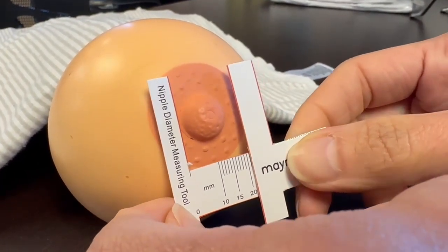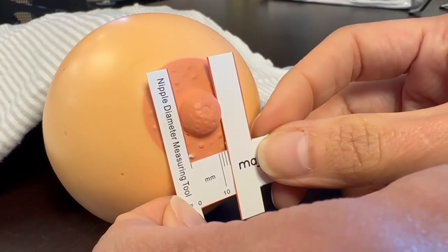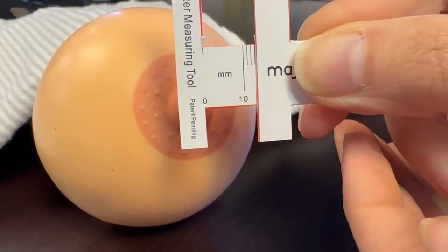There are various ways to measure for the correct size. Once you measure your nipple circumference you'll want to add two to three millimeters to that, and that is your starting point. You may have to try various sizes to get the right fit.